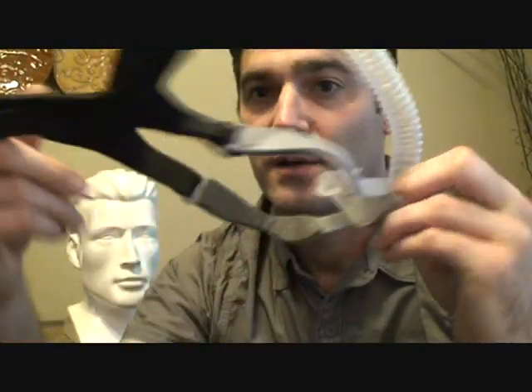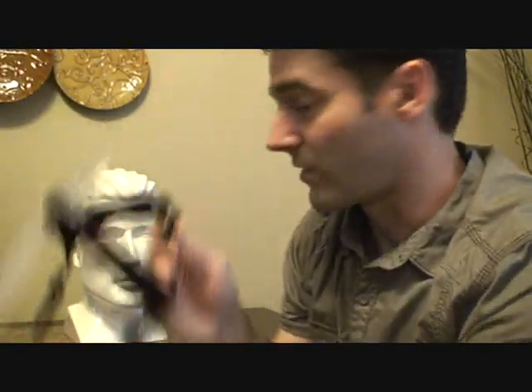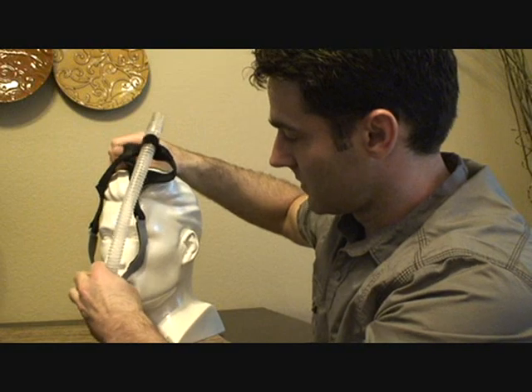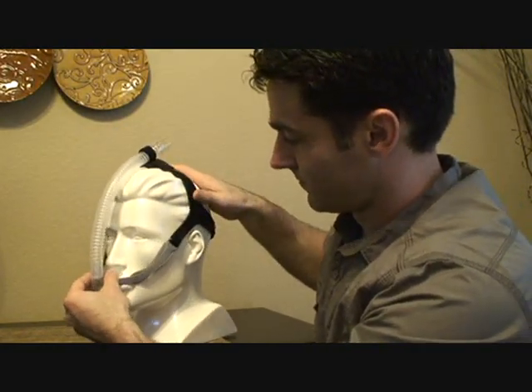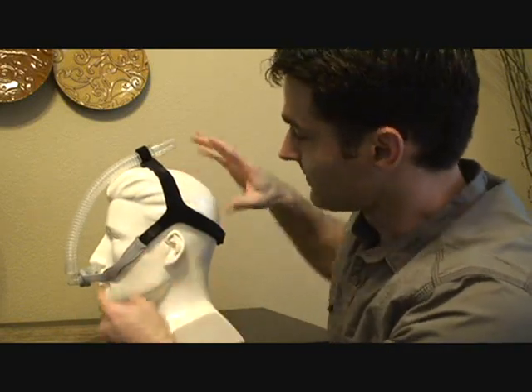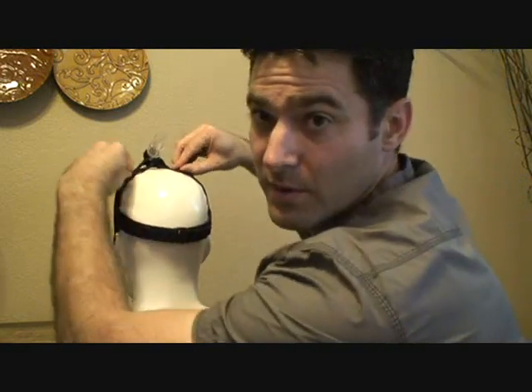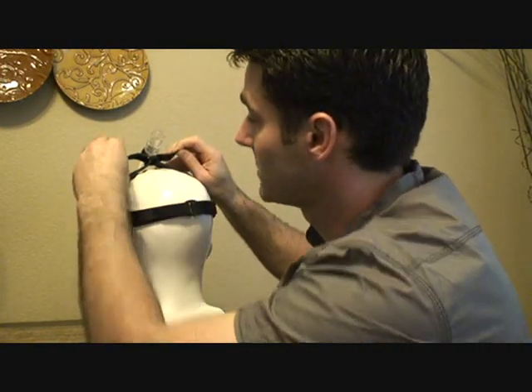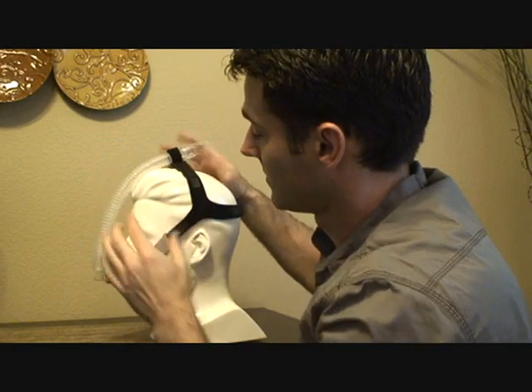What you do is take the nasal pillows, place them in the nose, and then pull it up over your head. It doesn't really have deep nostrils so it's kind of hard to get it to stick in there. On the top, if you need to tighten it up to bring it further into your nose, tighten it here — that'll bring it up.